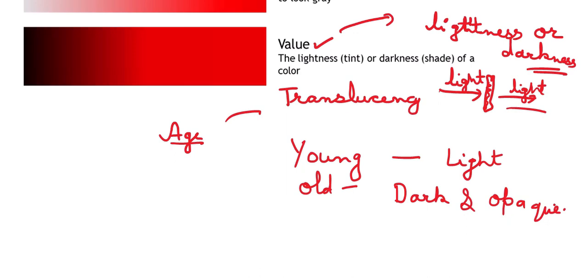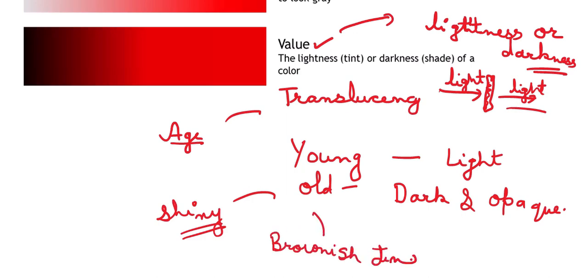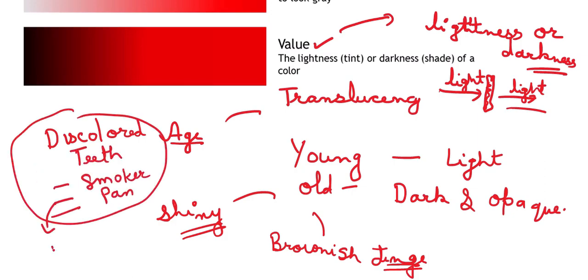The teeth in older individuals look shiny because regular wear of the teeth over time can result in a smooth appearance, giving older individuals' teeth a shinier look. Apart from that, you would see brownish tinge and discoloration that occurs due to the exposed dentine that tends to stain over time. Habits like smoking, alcohol consumption, and pan chewing can cause tooth discoloration due to the stains. So porcelain teeth are preferred for individuals with such habits.